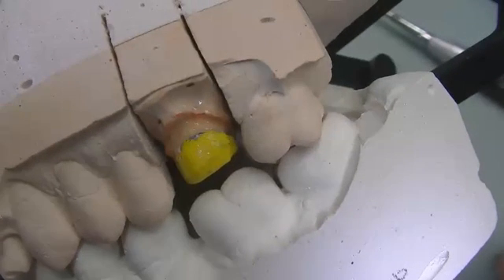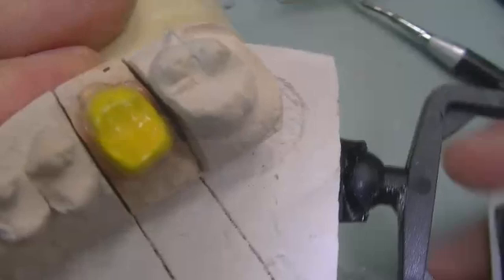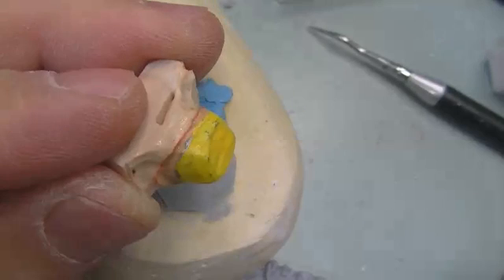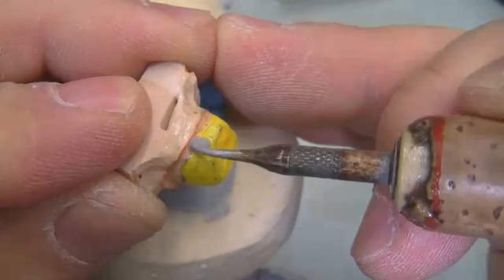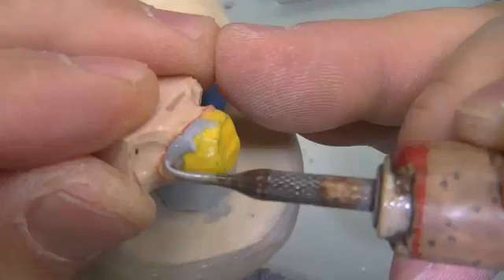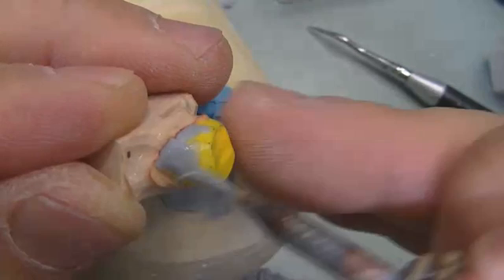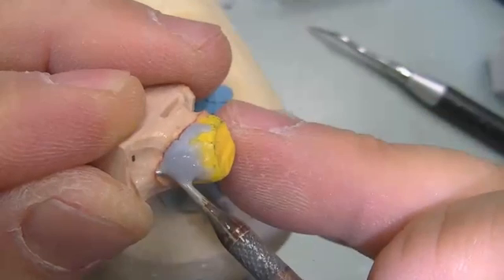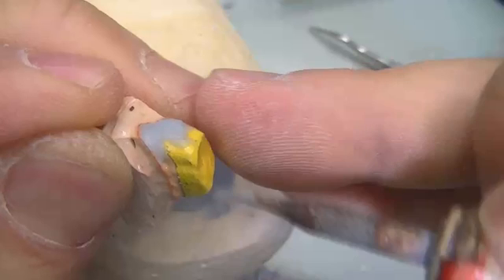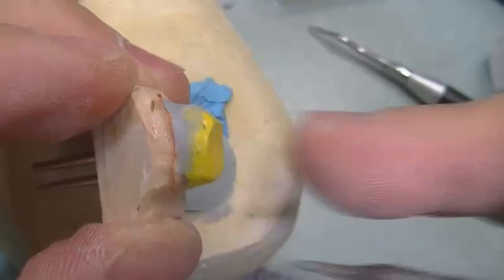Now we're going to start waxing the biggest tooth in the mouth: the maxillary upper first molar. We're going to lubricate it and apply some wax on top in pink. We'll wax around it — skipping ahead a little to save time, as the video needs to be under 15 minutes. Let's pause here and keep applying.